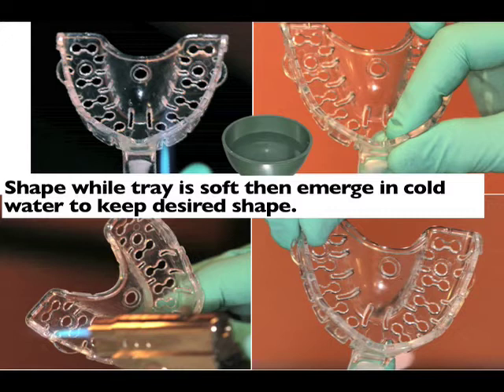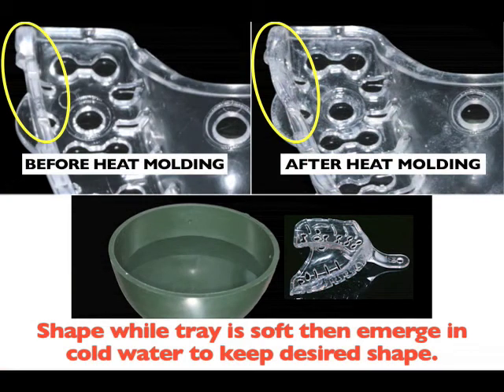Once we have bent the tray, we then immediately put it into cool water. Make sure it's completely cold before you put it back into the patient's mouth. Generally, one of the small, medium, or large sizes will fit most dental arches. You can see specifically where I have bent the tray outward to accommodate for a second molar. The tray didn't completely seat and it only needed to be bent slightly outward. Once it was bent outward, I placed it back into cold water, it re-solidified, and then re-tried it in the mouth.